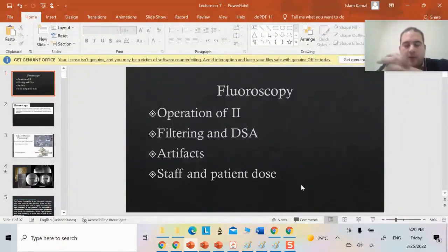The topic of fluoroscopy, in simple terms, is that the most challenging or cumbersome aspect is the image intensifier. As you all know, the function of fluoroscopy and its applications, in cases like cardiac angiography, for example, in diagnostic procedures, or even stenting or catheterization, and its function in interventional radiology, as well as its role in the operating theatre, such as in the installation of prostheses or orthopedic procedures, is quite extensive. In fluoroscopy, I rely on two things.